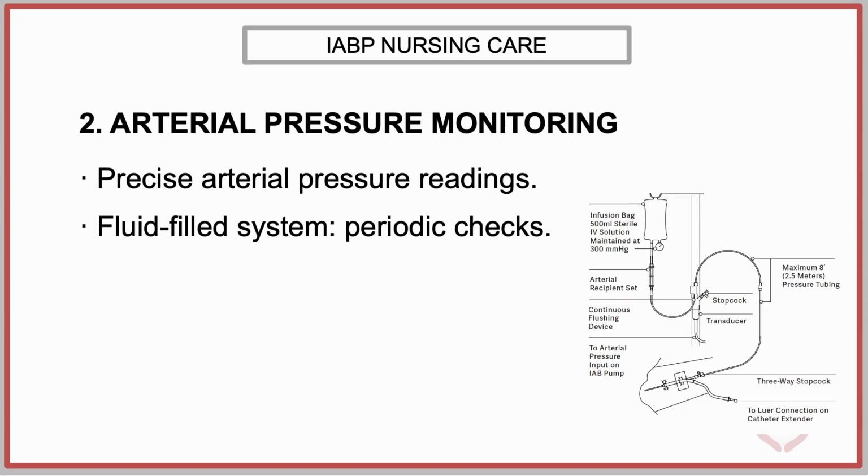If blood can be successfully aspirated, a rapid flush should be performed to clear the pressure tubing for at least 15 seconds. This maneuver should preferably be carried out with the IABP console placed on standby to prevent inappropriate balloon triggering during flushing.